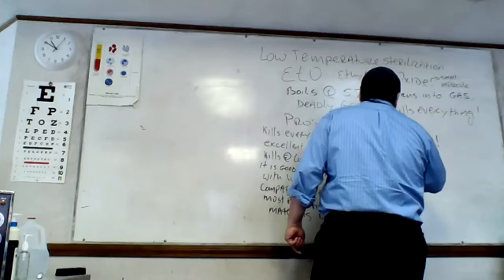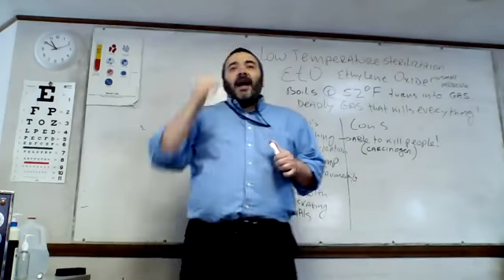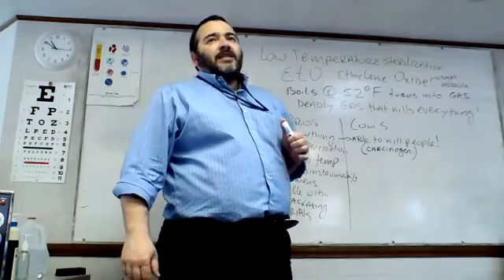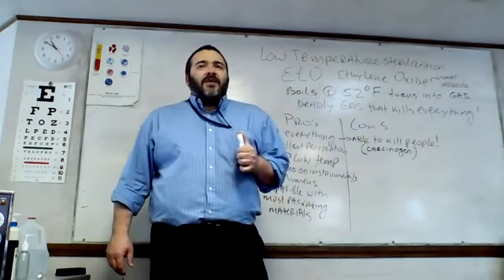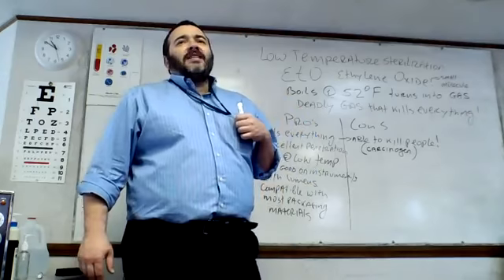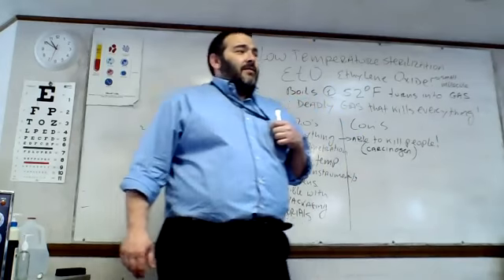It's a carcinogen. That's a biggie. So I am here to tell you that this particular medium for sterilization, though it's used in some places, is by far not used everywhere because of this specific reason. Only specialty departments and specialty hospitals have this. Not everyone has it. All right?